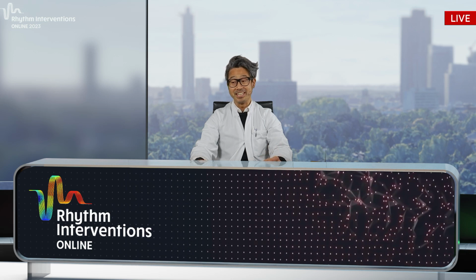A live case, simplified mapping and ablation of iatrogenic AT using the Carto mapping system, and this is also interesting, in the day surgery setting, from Rhythm course director Richard Schilling from his center, One Welbeck in London.